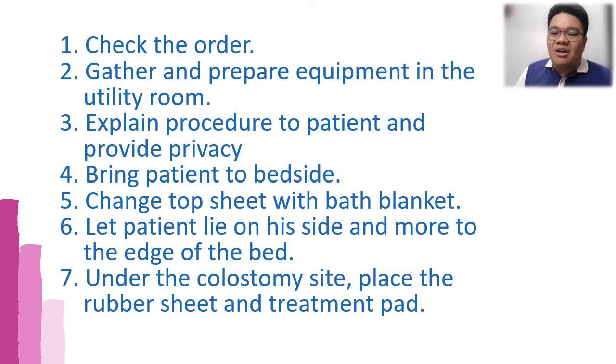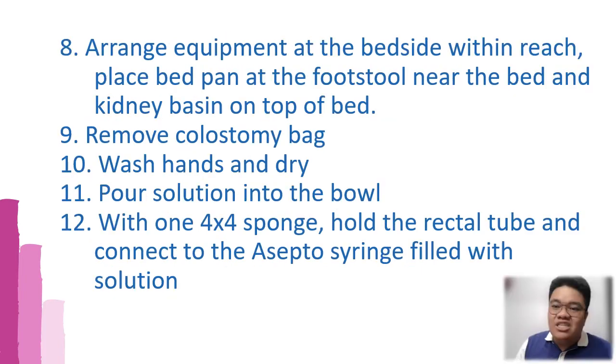And then under the colostomy site, you place the rubber sheet and the treatment pad for that matter. Then you arrange the equipment at the bedside within reach. And then you need to place the bedpan at the footstool near the bed and the kidney basin on top of the bed. You might be thinking, why the bedpan on the footstool?